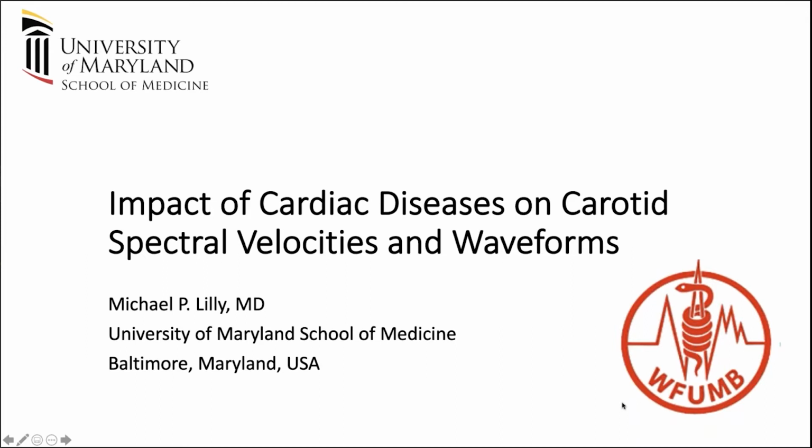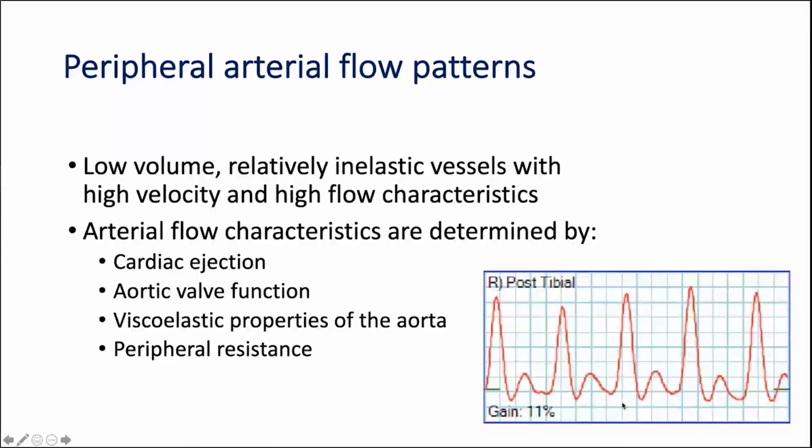My talk is more of a, I guess we'd say, show and tell of some features of carotid duplex that may not be things that we commonly think about in the diagnostic laboratory. So my focus is on the impact of cardiac disease on carotid velocity spectra and waveforms. I have no disclosures relevant to the topics within this talk.